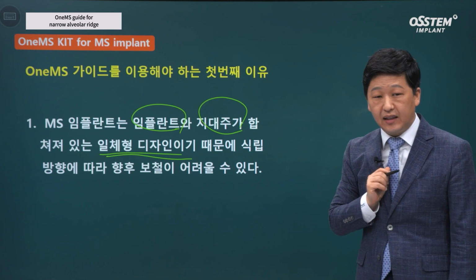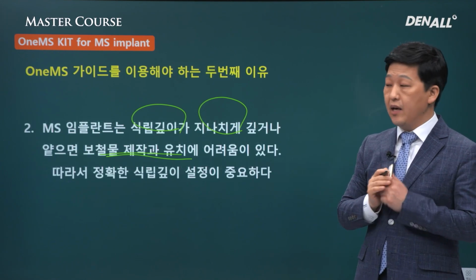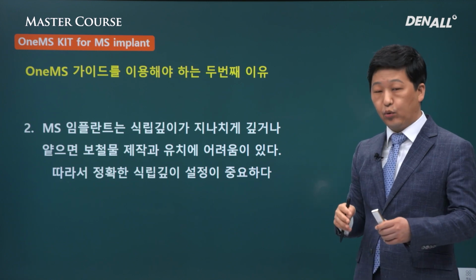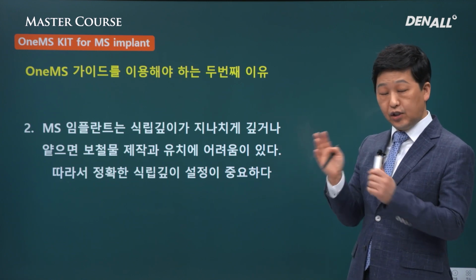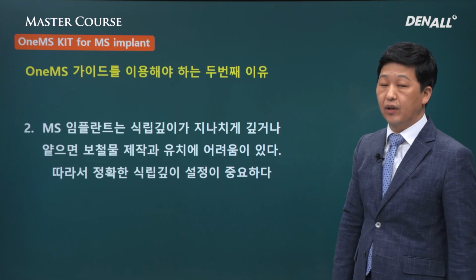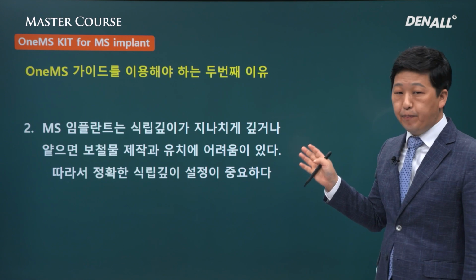Depending on placement direction, prosthesis process can be difficult if implant is buccally tilted or lingually tilted. If it is mesiodistally deviated, prosthesis may be difficult to provide.